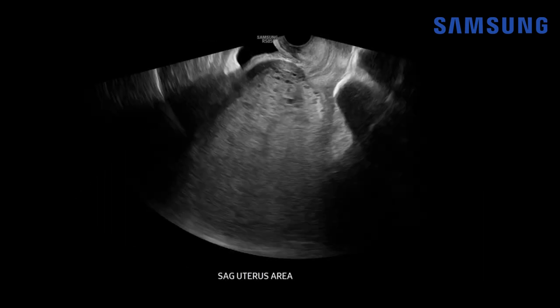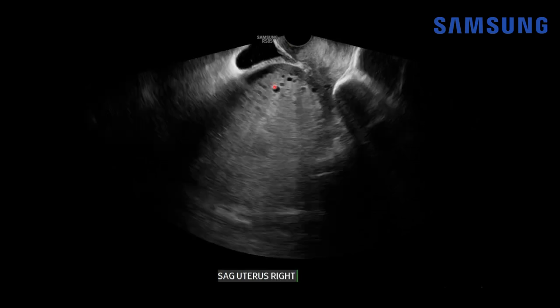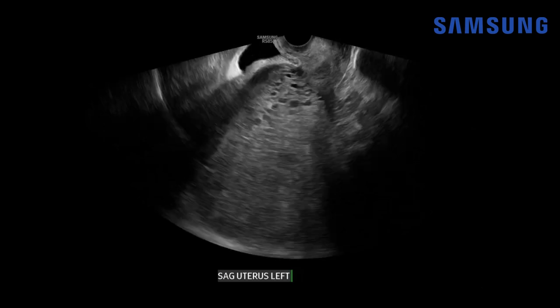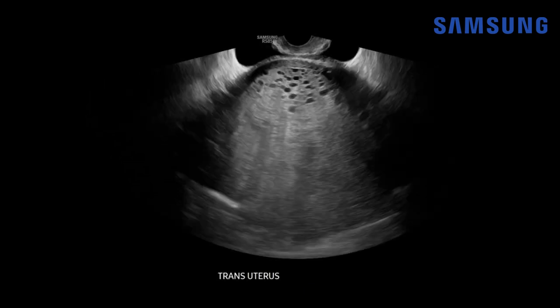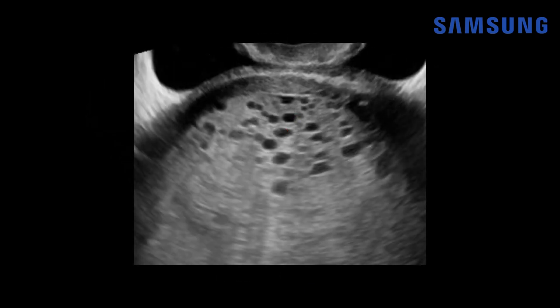Now we're looking at transvaginal images. Here's the transducer tip at the cervix, and then the lower uterine segment expanding out. You can see this thin rind of myometrium, and then all that heterogeneous echogenic material within the endometrial cavity. Note how we don't see the fundal region quite as clearly on these transvaginal images because of the increased distance from the transducer. We do get a great look at the echotexture of this area within the lower uterus, and as we zoom in, you can see these cystic areas quite well.